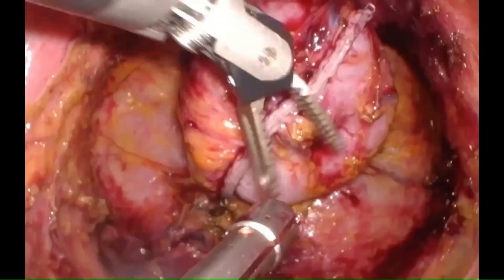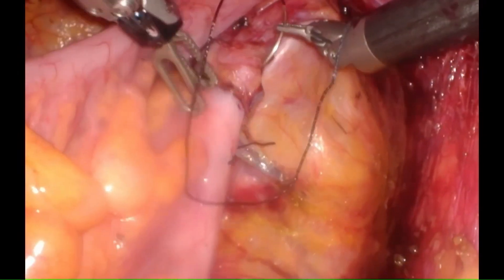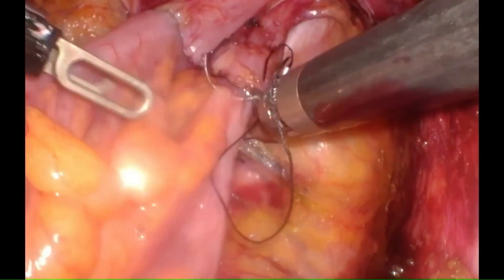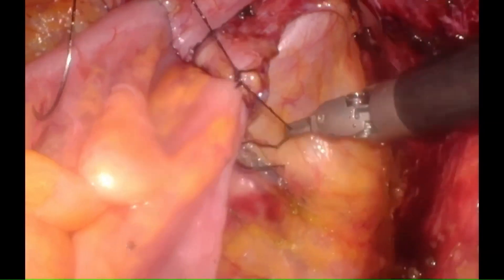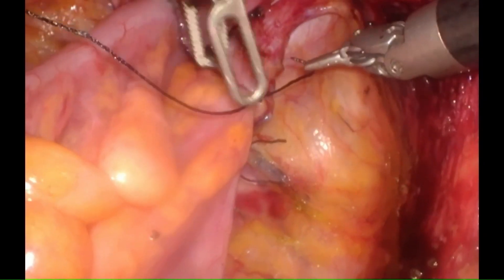We then perform an intracorporeal colonic anastomosis using a circular stapler. A second layer of interrupted sutures can be easily placed over the anastomosis with the help of the robot, even in a narrow deep pelvis.